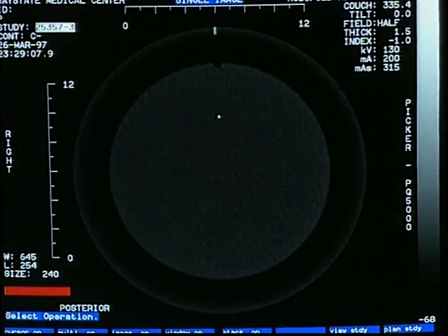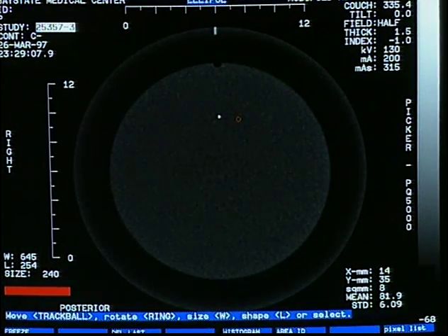All Catphan models use a very dense tungsten carbide bead to create a point source signal for the modulation transfer function, or MTF, plot. This patented bead design eliminates the errors which can be caused by misaligned wires. The reason we moved away from the thin wire as a point source to a small isolated bead was because a bead is much easier to align.